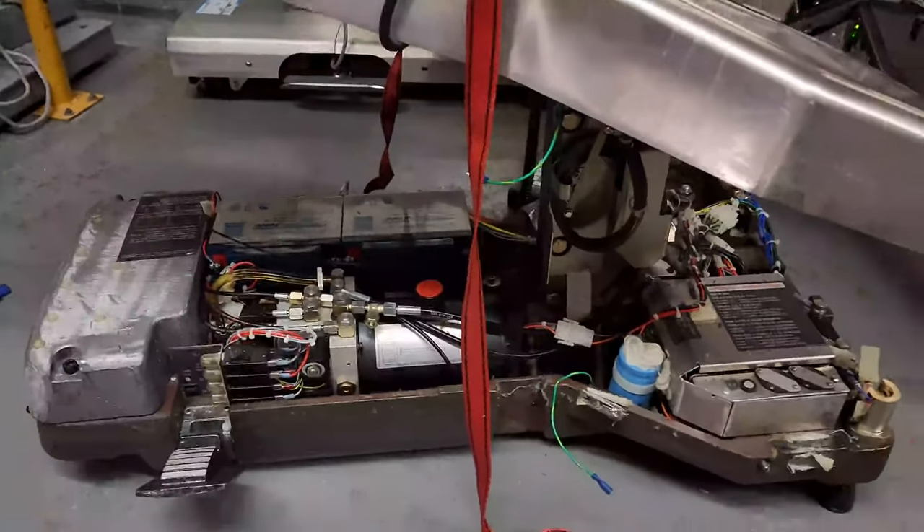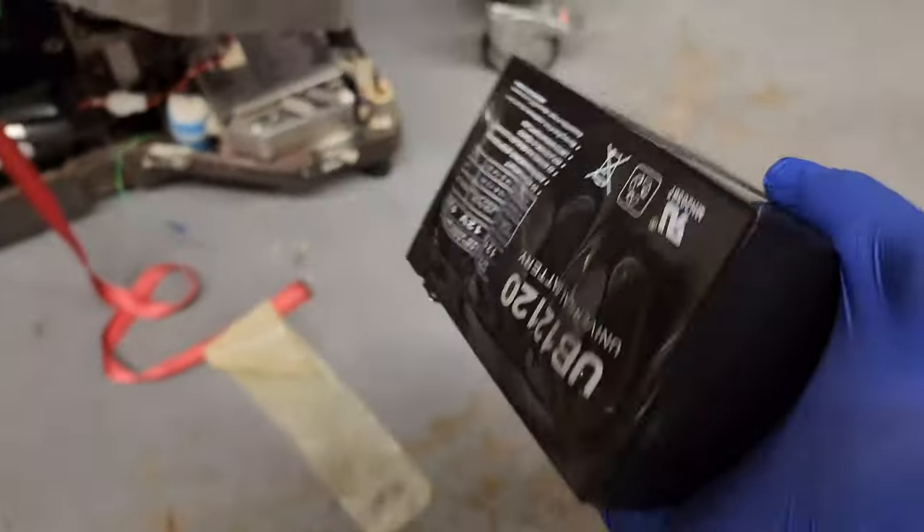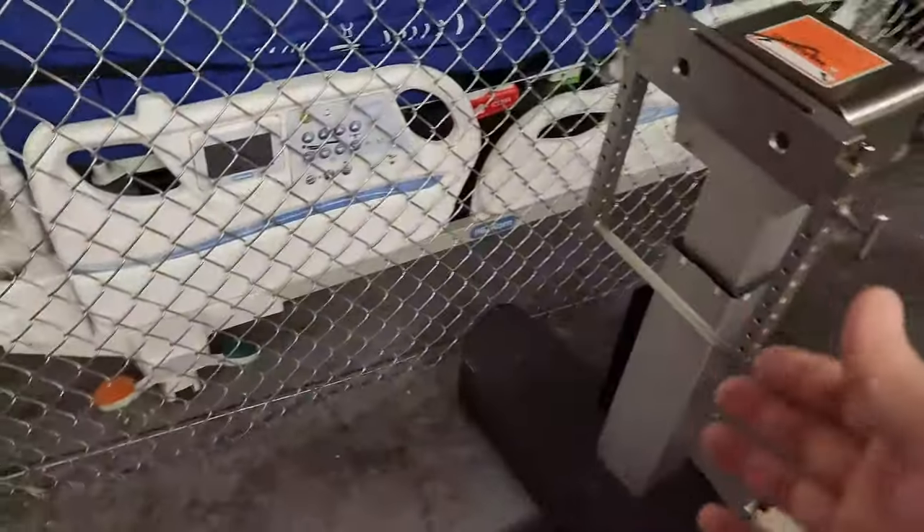Take a look at this — this is what happens when batteries get a little bit old. This comes from the spine table, or the Jackson table — this is a Mizuho OSI spine table.